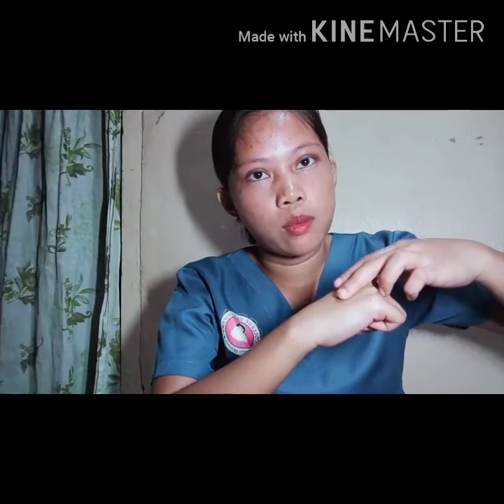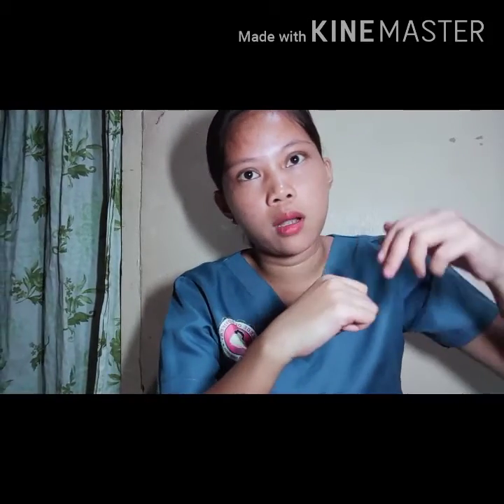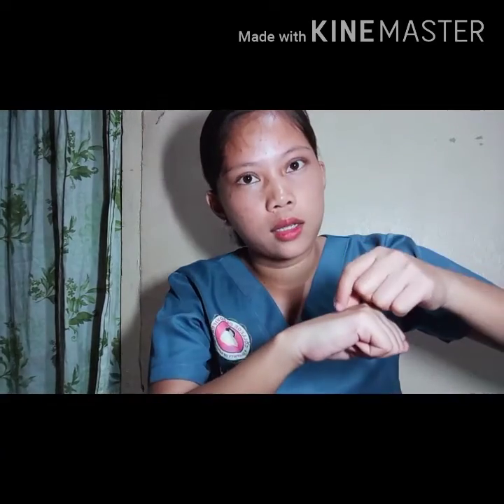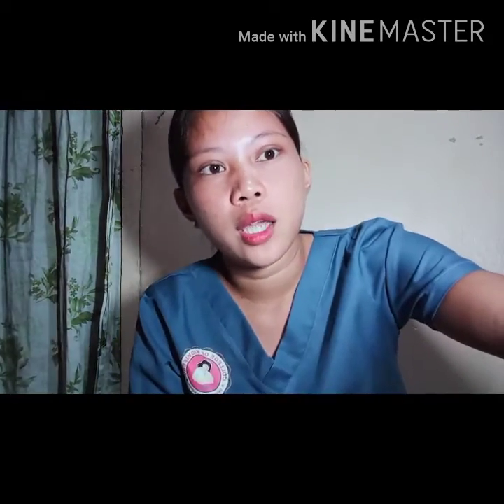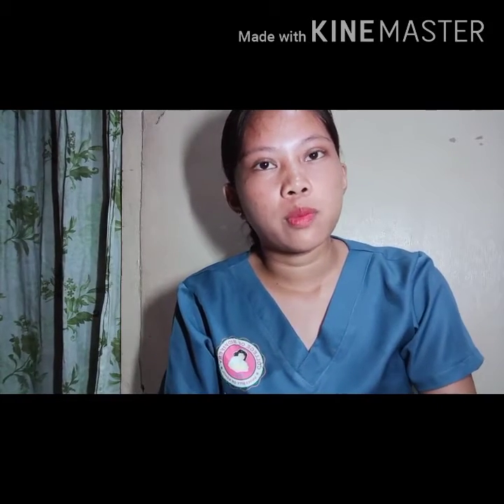So after ato imuhang ilak kay mag-release man ka sa needle, imuhang ipagawas ilak sa to nimo para safe ka sa needle. So after ato nga nalak, after ka nakalock and nakakuha na ka, so i-release na nimo ang tourniquet. After nimo i-release ang tourniquet, so apply pressure.